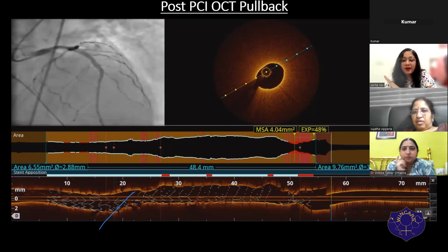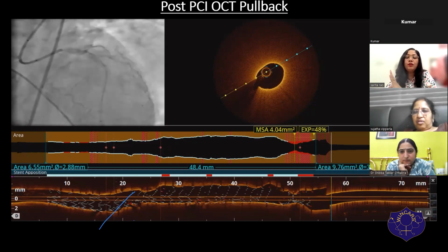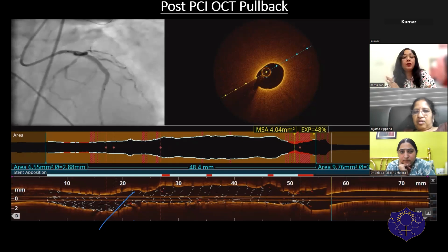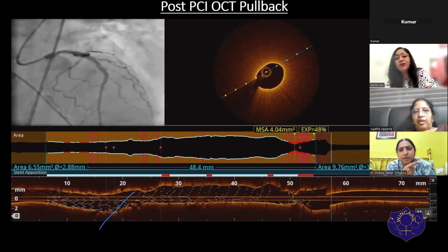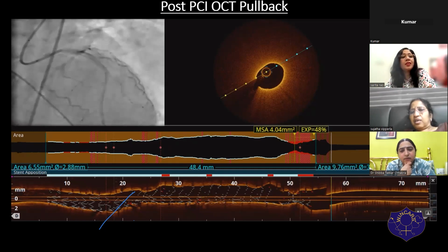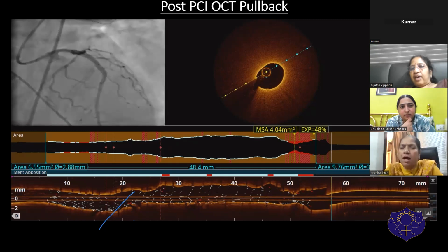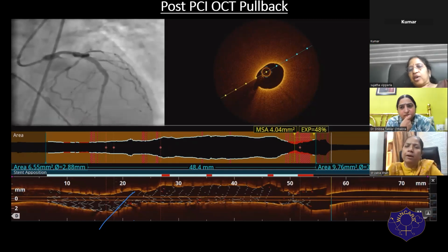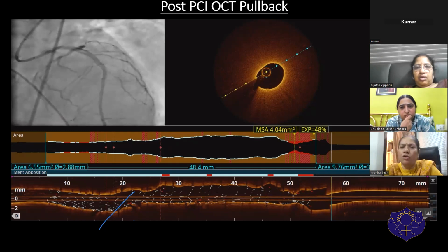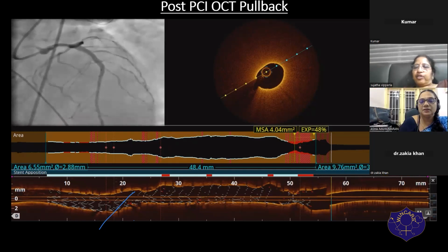So I did my entire homework and research, and I knew that this patient is not going to have slow flow, is not going to have bradycardia, because orbital doesn't produce either of these. Why did you put a temporary pacemaker lead there? I think TPI is more often now put only in RCA, if you are doing a rota of RCA. People recommend it, otherwise not for the left. That's what I think. We are using aminophylline infusion.